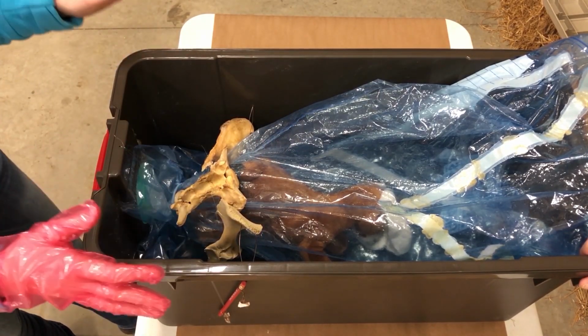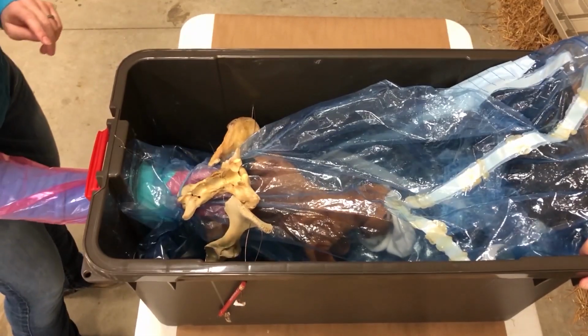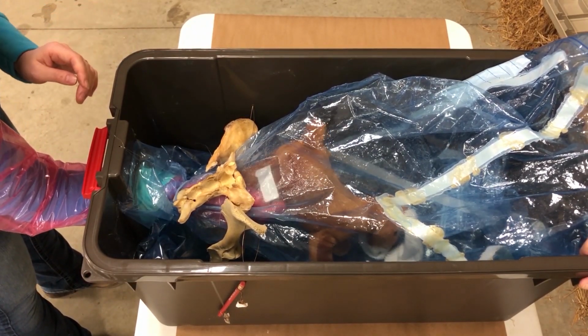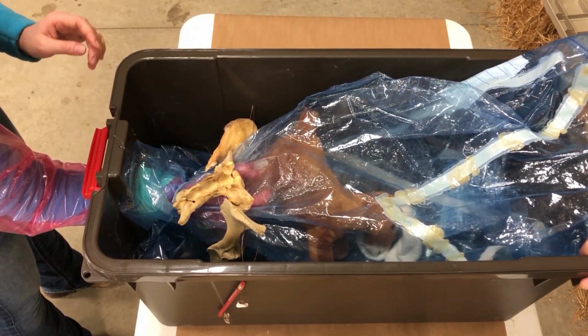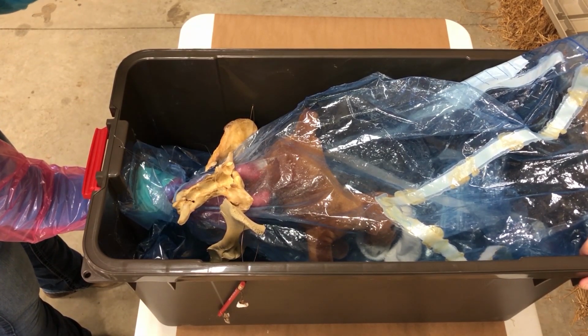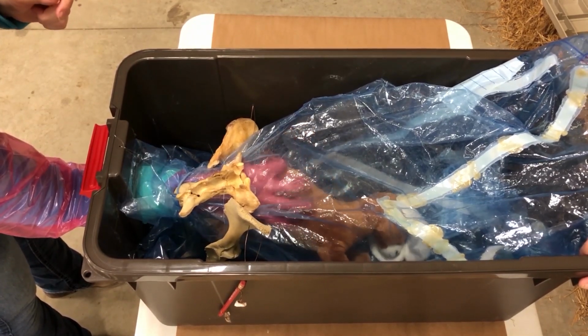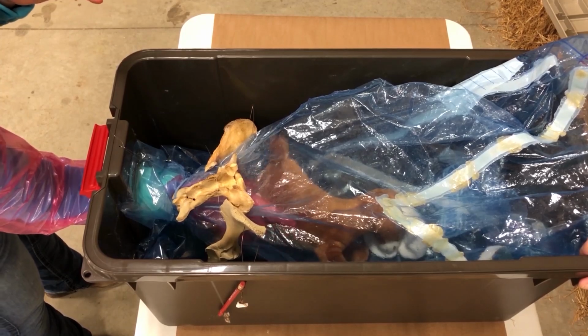Today we've got a goat here, she's pushing pretty hard. We go back in and we feel, we've definitely got back legs. I can feel on these back legs that hock. It almost feels like an elbow point. It's really sharp and pointy compared to that front leg. And we've got a tail. I definitely know I don't have a head.